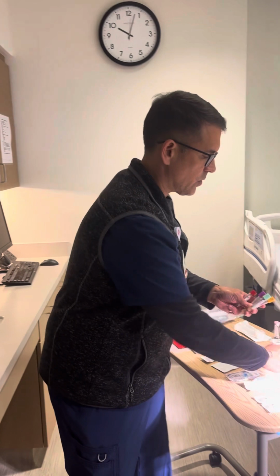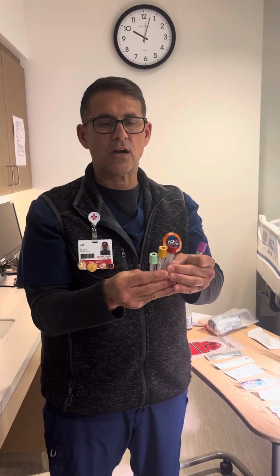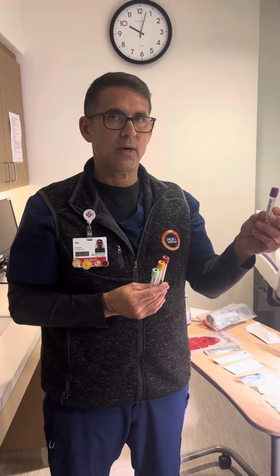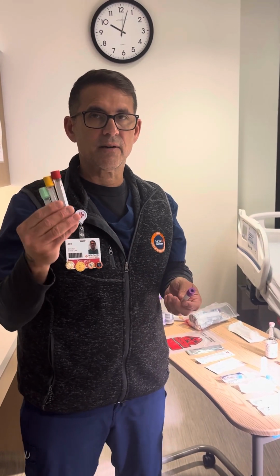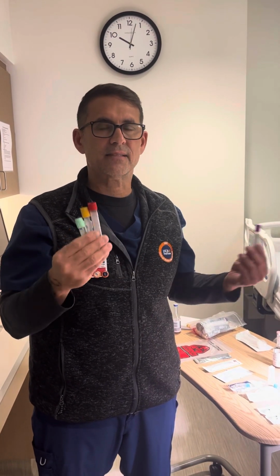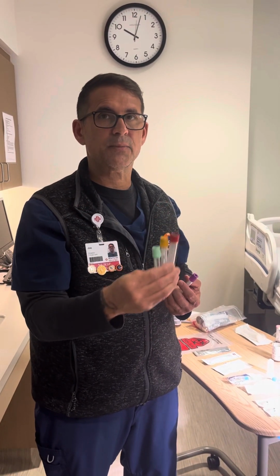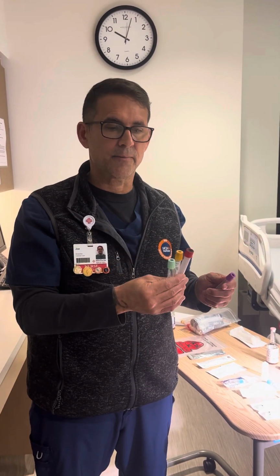These three tubes right here are collected to analyze serum. This one is collected to analyze blood cells. To be able to analyze serum, the blood has to clot. So if somebody says, "I couldn't run the green top because it was clotted," that doesn't make sense, because the green top, the yellow top, and the red top are supposed to clot. These are the ones they spin down in the machine down there, and they extract all the blood cells and test the serum.